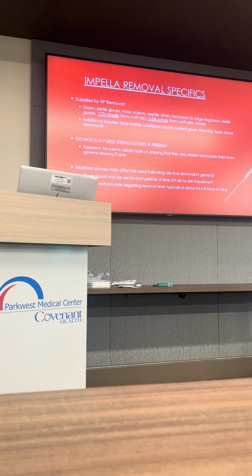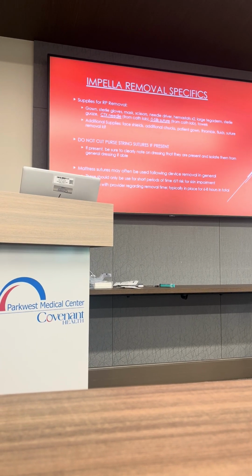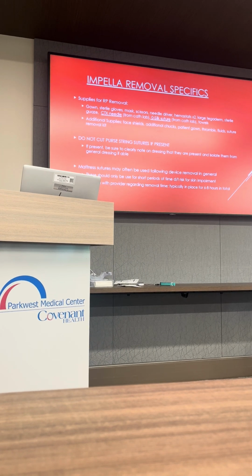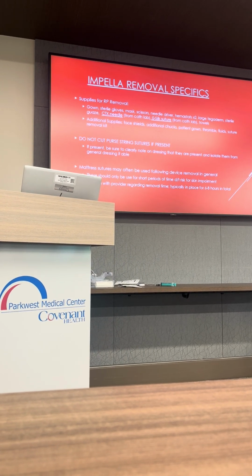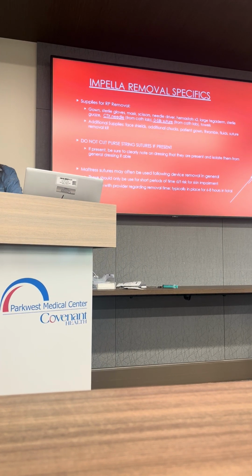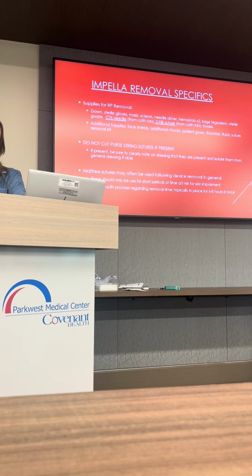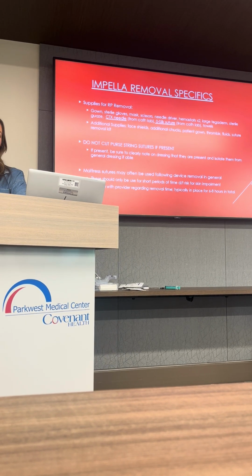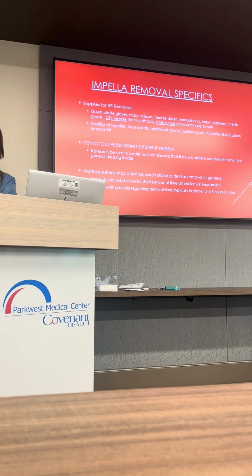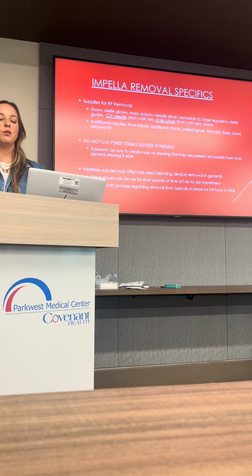If you've got a patient that's awake that has a mattress suture in place, they can often tell you that it's a little uncomfortable. There's been a few times I'll go upstairs to CTSU or places like that post-procedurally, and I'm checking on these patients and I'm going there to remove that. If they've been up and moving around, or if they are awake and mobile enough, they can often say that it may feel a little tight. And so again, that's just something to be mindful of. People are at risk for breakdown with that, and so we need to know, hey, it's in place, but then also when the ideal removal time will be.